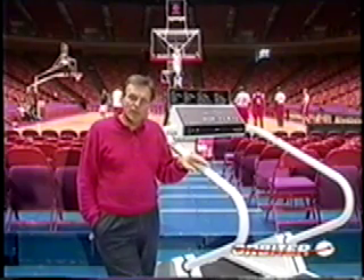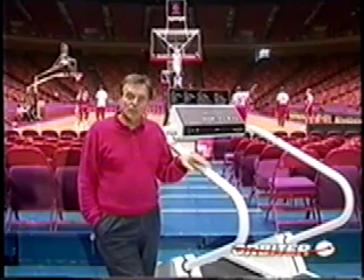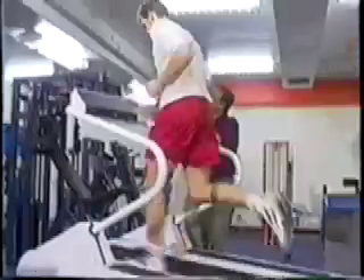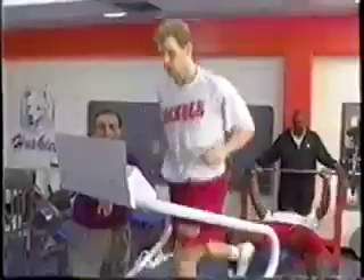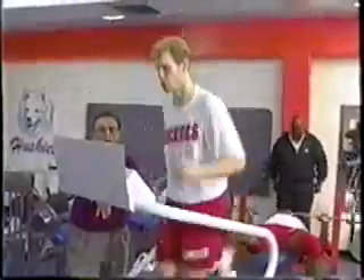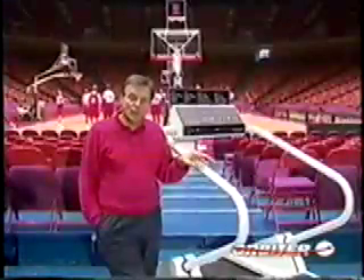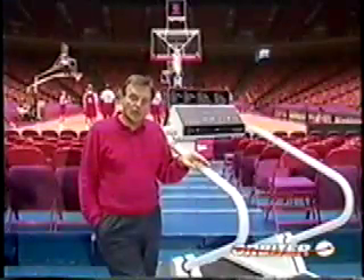So for rehabilitation of injuries, this is the only treadmill to use because of the low impact that we have at heel strike. While he's on the treadmill, we don't have that trauma to the joints — ankles, knees, hips, and low back as well.